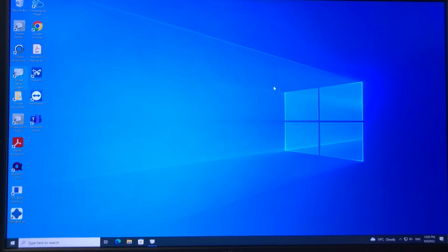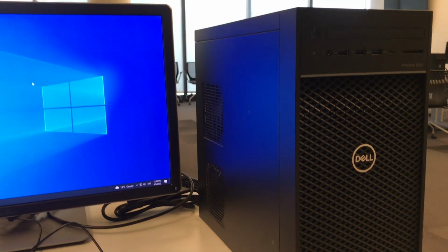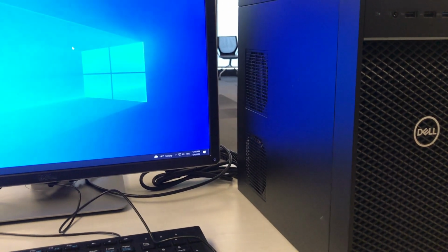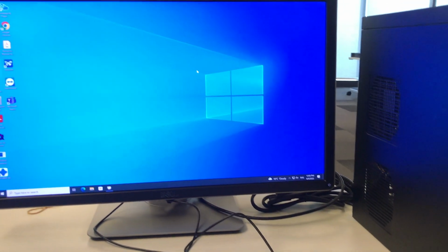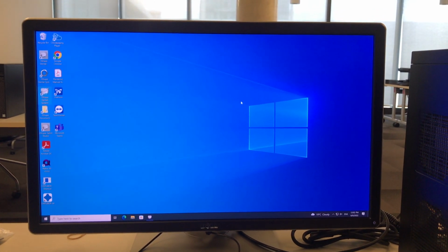So a couple of things that we need to keep in mind, that we need to have as far as designing digital dentures. Obviously, we need the software, and using a desktop CPU with ample memory and very good graphics is very important, and also a good size screen that you see there.